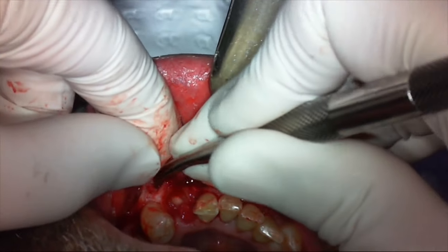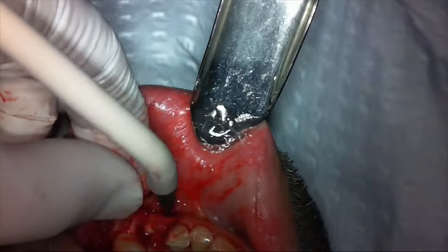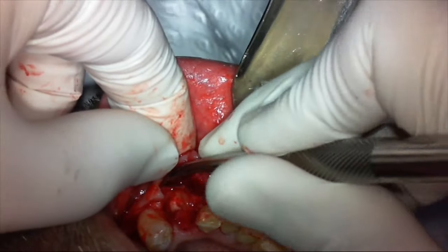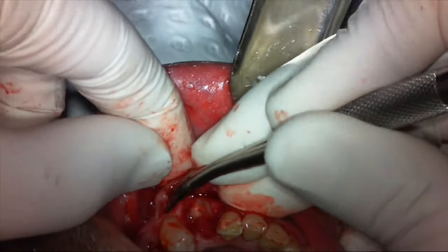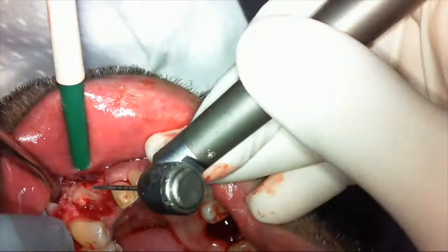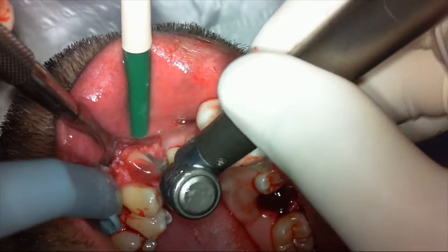This canine was actually double-rooted, so there is the option of sectioning in a mesial-distal direction — sectioning the buccal half and the lingual half of the root and elevating each part separately. But in this case, because I have a lot of space on the mesial and distal due to the crowding, I decided to use my favorite bur.